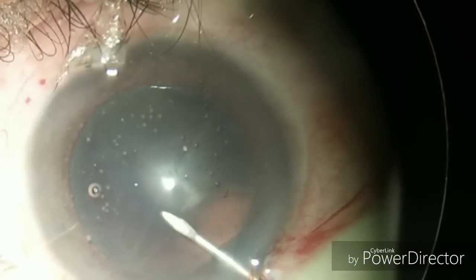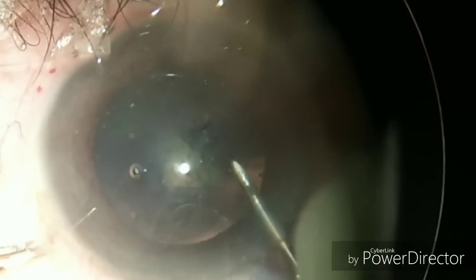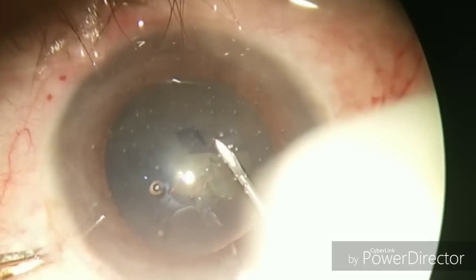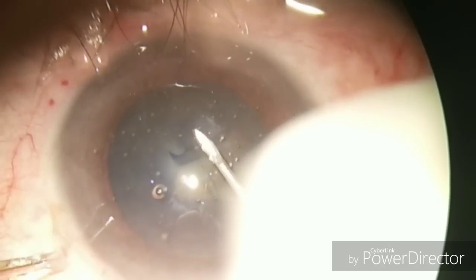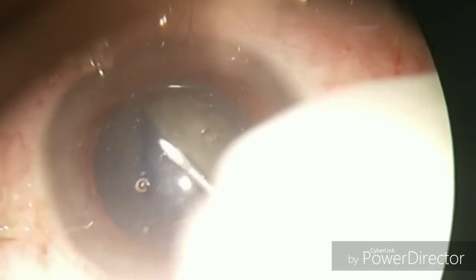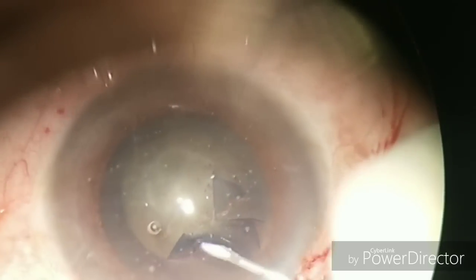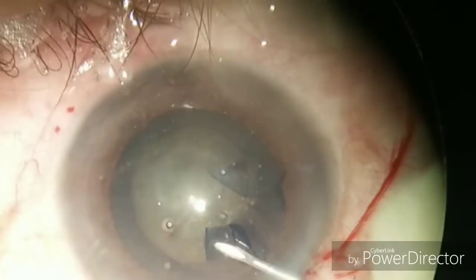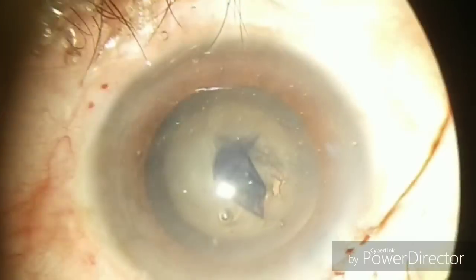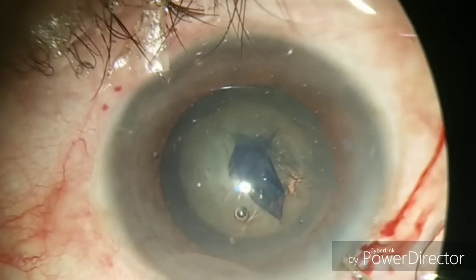In the final video: make a straight cut, then elevate the flap. At any point if you think the anterior chamber is shallowing, come out, put gel, and then start again. Moving slowly and gradually gives you more command over the capsulorhexis. You can also practice capsulorhexis on tomatoes. That was all about capsulorhexis — I hope you have learned. Thank you.